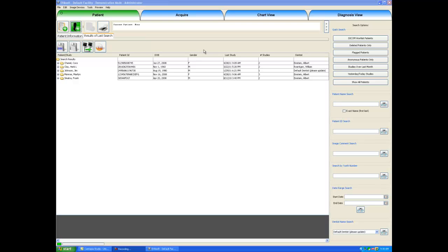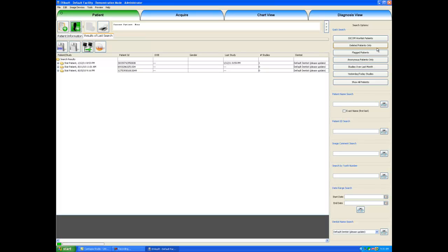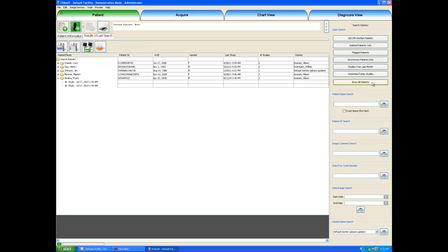On the right-hand side of the patient tab, we have our search options. For example, in the quick search field, these buttons here, I could click on yesterday today studies to see which x-rays I had taken yesterday or today, or I could click on deleted patients to see which patients I have historically deleted. I will click on show all patients, and that will show me every patient in our database.